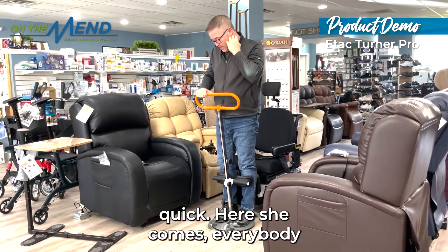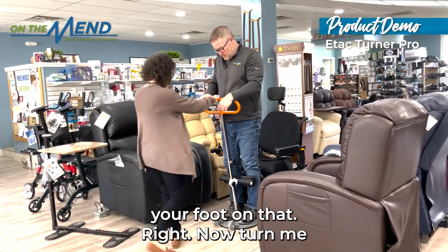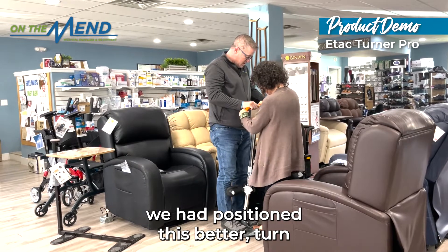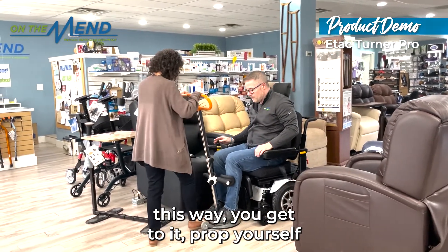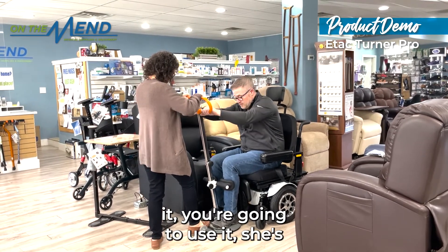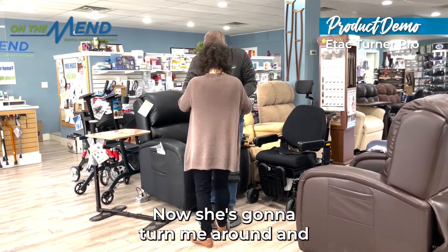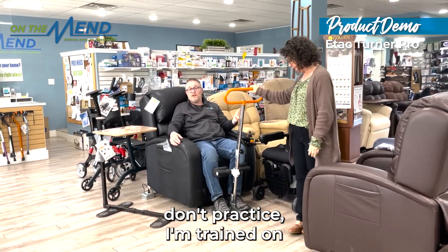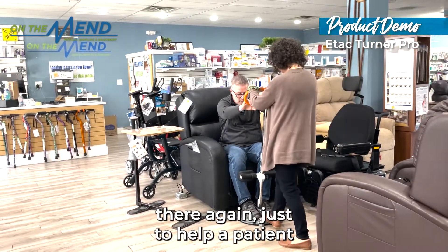If you want to come over here, Christine — everybody knows Christine. Put your foot on that and turn me this way. There you go, now I'd be turned. Turn me back, let me sit back down. Imagine using your caregiver this way: you get to it, prop yourself up, come into it, use it. She keeps the weight on it, you pull yourself up and hold on. He's going to turn me around, and now I'm going to sit down into my chair. With some practice — which we don't have — it's really something, and you can use this as a mobile device to help a patient.